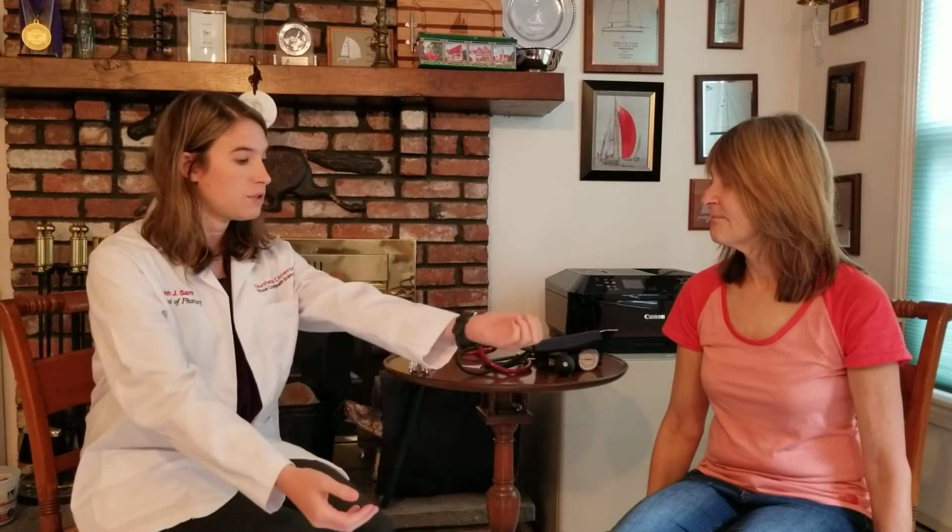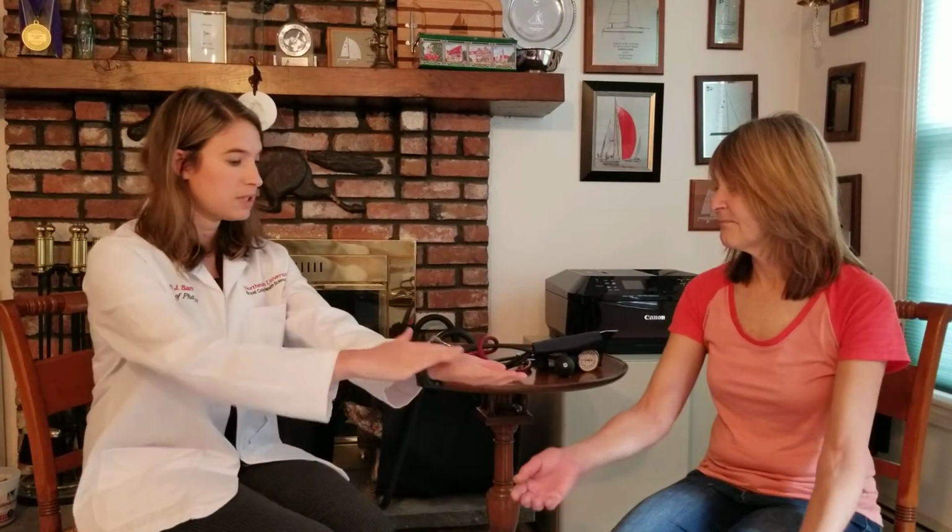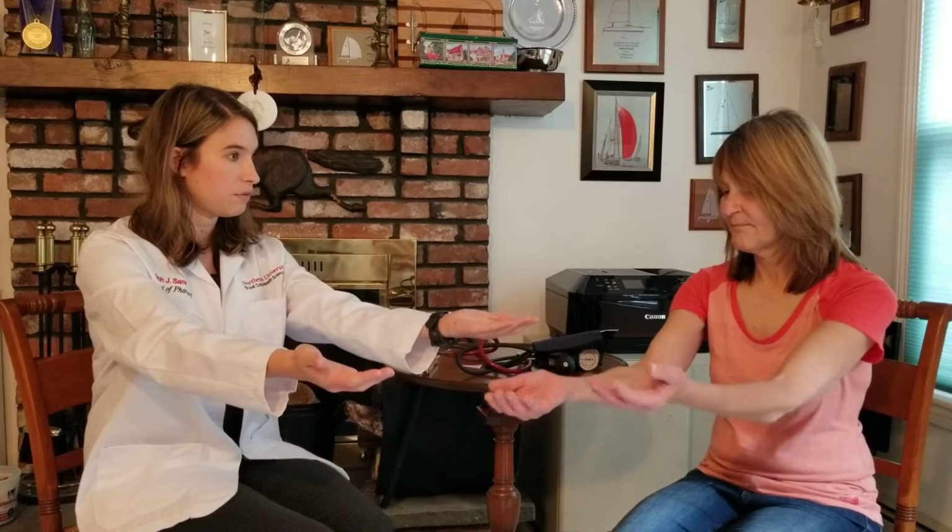So first I'm going to have you sit down just like you are now. I'm going to have you put your feet flat on the floor so your legs are not crossed. And then I'm going to have you relax your arms, make sure that they're not supported at all, and then lift them, holding it straight out like this, about the level of your heart.